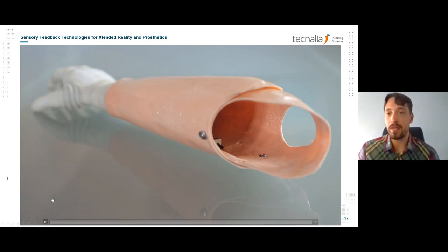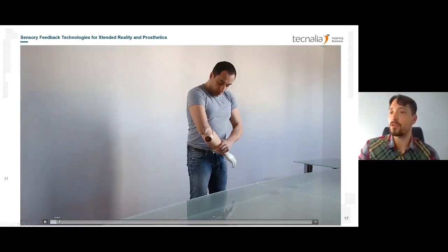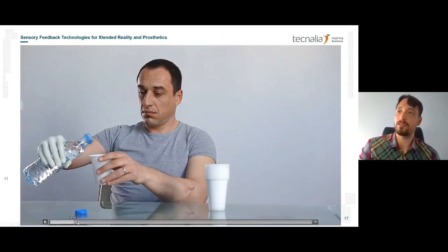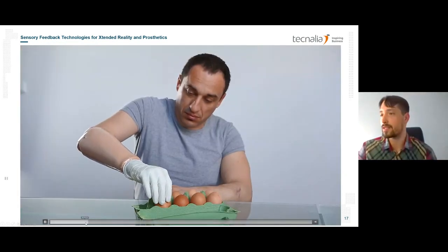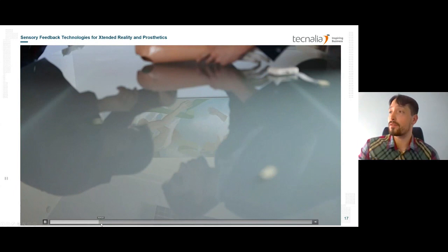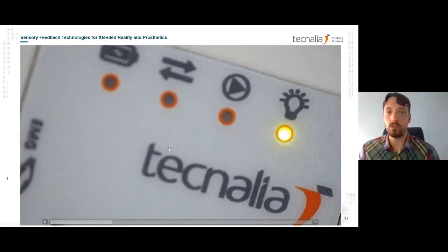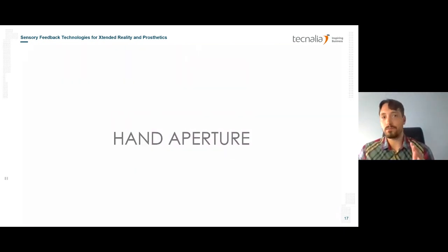This is, let's say, the Maxence promo video that we made. I will not go through the beginning of the video because it basically shows the idea, the concept that I already described: how the user without feedback is not so proficient with the use of the prosthesis because he is not able to tell what force he is applying, etc. And then we designed this type of electrotactile feedback that should allow him to get this type of information. But this is now important: the coding schemes that we designed to be intuitive should allow the user to feel it as part of their own body. So think about this now.